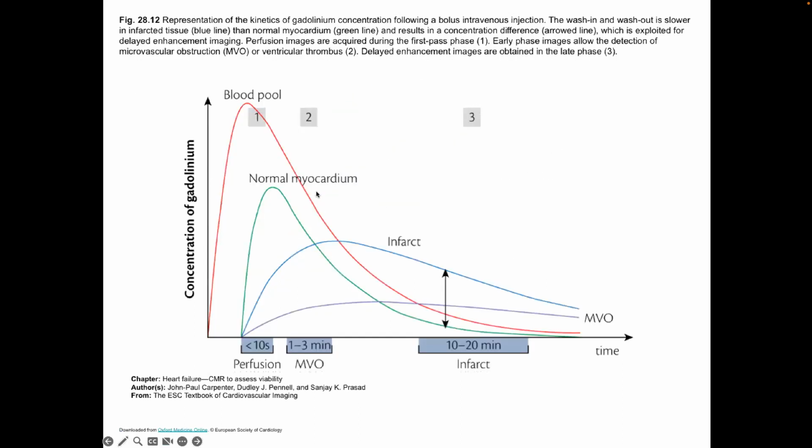The next thing we're going to look at is this effect in MR where you get this late gadolinium enhancement, or a real brightness in some tissues in the heart. And those tissues that have this real brightness on T1 based imaging are normally infarcts. So they're tissues that are dead, essentially. They can still have flow, like the contrast gets into those tissues through some vascular access, but it sticks around for a long time, right?